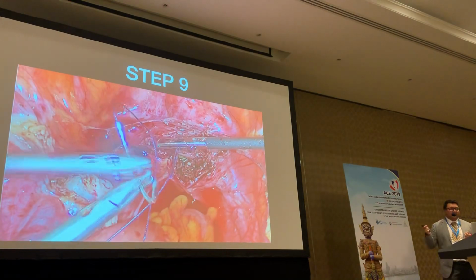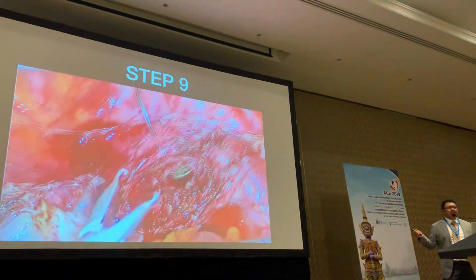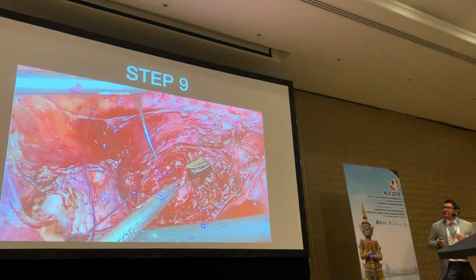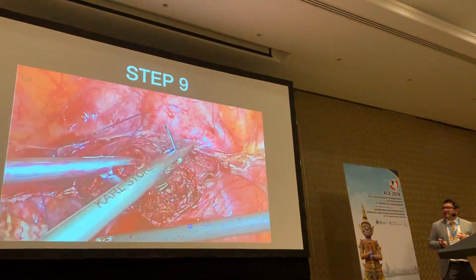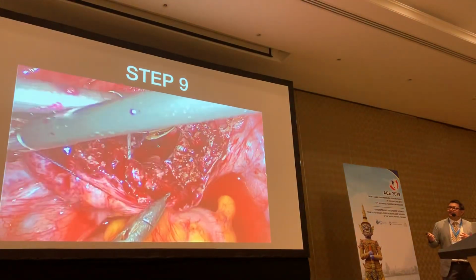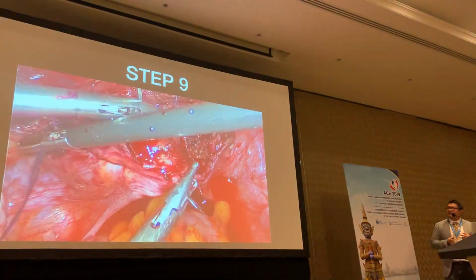I will reperitonize at the end, so that's my second layer. Not as extensively as Masaki Ando showed yesterday. I'm just over the raw area. I don't go round ligament to round ligament, but that's a good technique if you have the time. So maybe a figure of 8 at the left angle. Then I will cut it and continue from the right side.